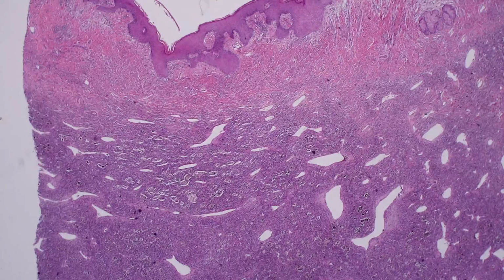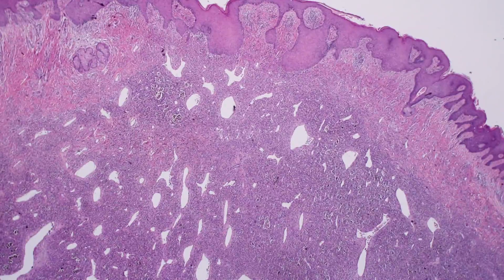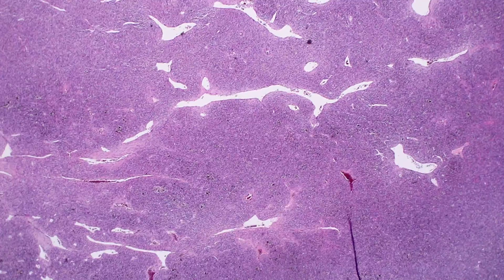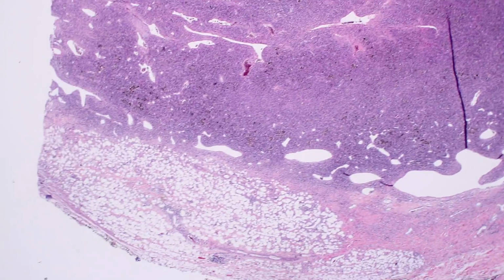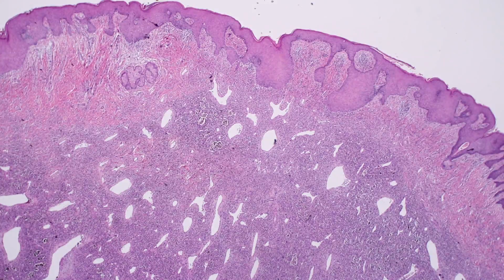Here's a really nice example of the upper end of the range that you can see for dermatofibromas. This is so huge, I can't even fit it under the whole scope on a 2x objective. It just goes and goes and goes down, all the way into the subcutis and even trickles into the subcutis. Very large. This is an excision specimen.